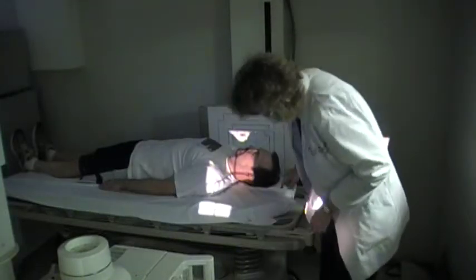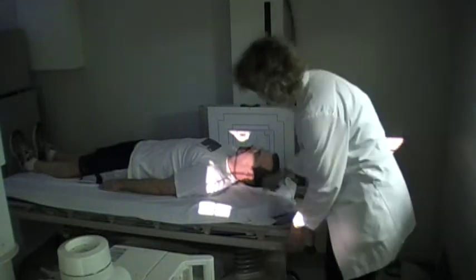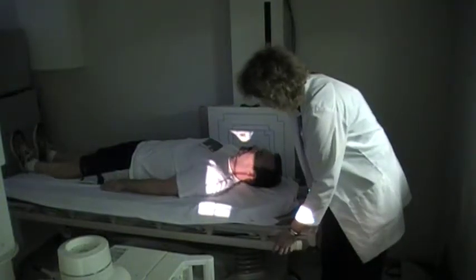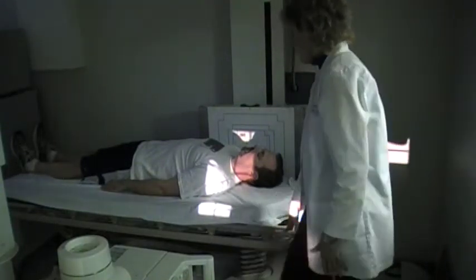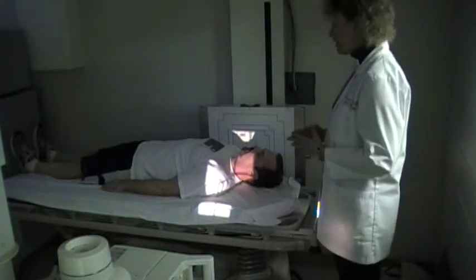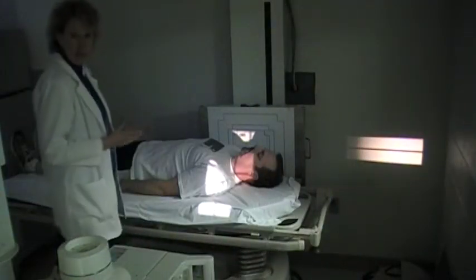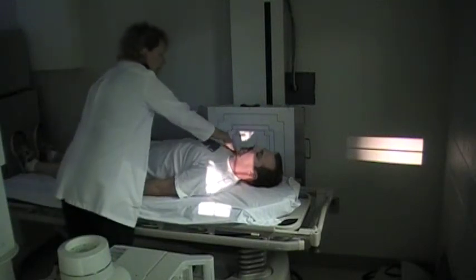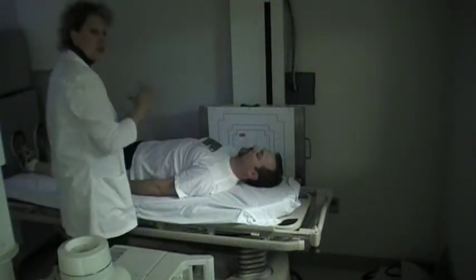For the cervical spine, you're going to want to locate the thyroid cartilage. You can see the prominence of it, so go to that upper edge of the thyroid cartilage to center at C4. Next, you want the shoulders to be relaxed down so you can see more of the spine. Speak to your patient and let them know you're just going to pull their arms down. If they have an injury to the shoulder or arm, you won't be able to do much with that.